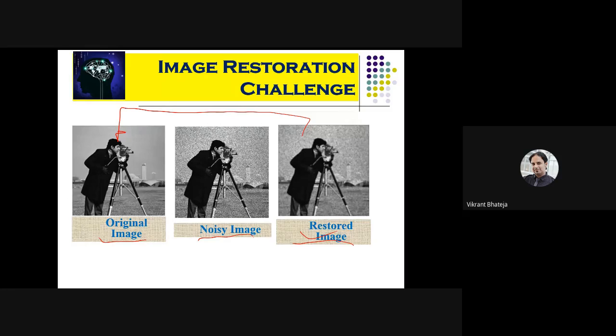Then certainly it becomes very difficult to compare that improved image with the original image, which was actually a not improved version, or an inferior version of that image. So this is the prominent problem that we face while analyzing the quality of medical images, because your initial images are not that good that they could be treated as a reference for your experiments.